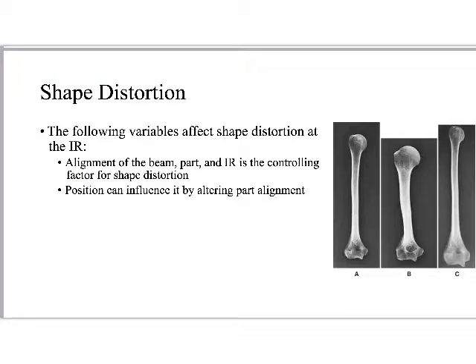This is really crazy, confusing stuff, y'all, right? I mean, this is a lot of detail. Is this what you thought you were getting yourself into when you signed up for X-ray tech school? We're now officially at depth, right? We're at that point in y'all's career where I start looking at y'all as equals. I've taught you just about everything that I know on this subject. There's some fine stuff that we still need to go over with safety and with digital, but you have a lot of the tools that I have to make better pictures, right? How you apply this in the clinical setting is what's critical. So I'm giving you all the definitions today, and breaking this down as much as possible.